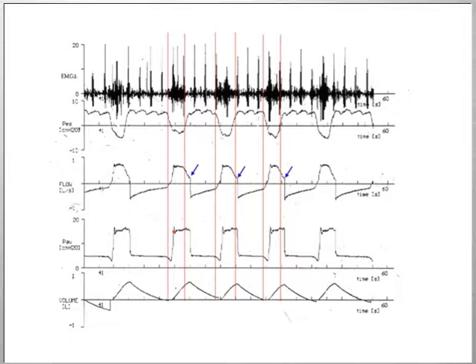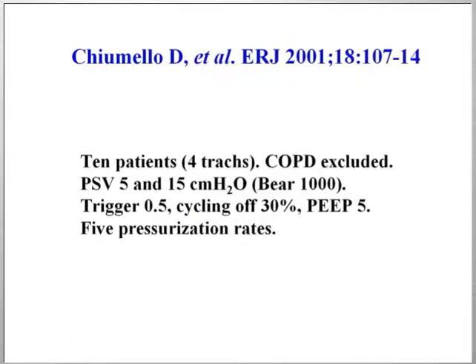Of course, there are a couple of other characteristics with pressure support ventilation, which are the triggering here, and also the pressurization phase, where the ventilator maintains a constant inspiratory pressure as previously set by the caregiver. And all these characteristics, the triggering phase, the pressurization phase with its pressurization ramp here, and the cycling criteria all influence patient-ventilator interactions, breathing pattern, and inspiratory muscle effort. And I'll go through this briefly in the next following minutes.